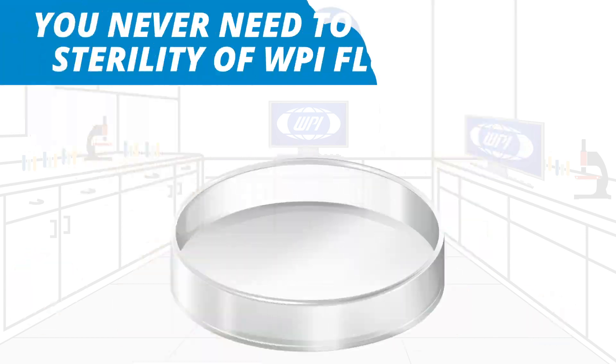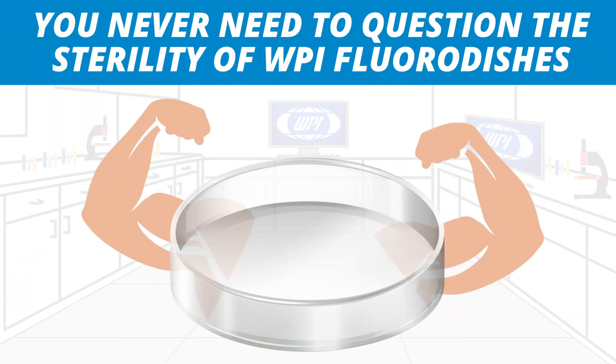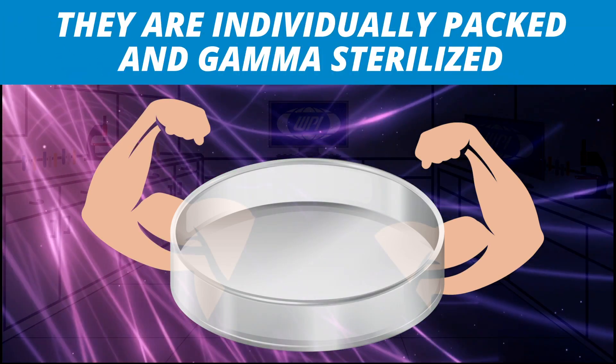You never need to question the sterility of WPI FluoroDishes. They are individually packaged and gamma sterilized.